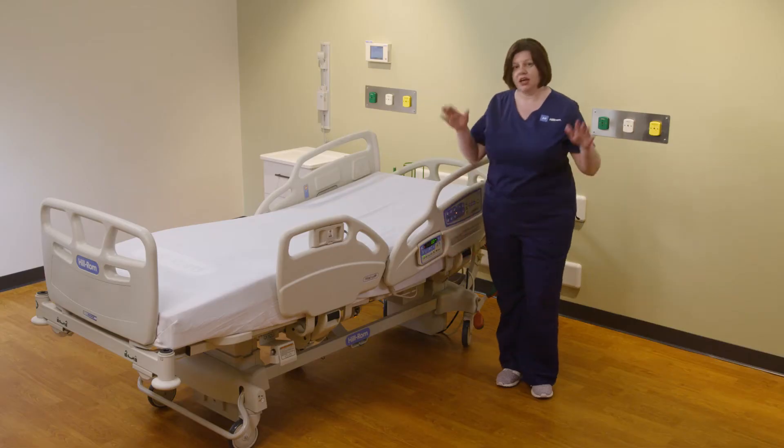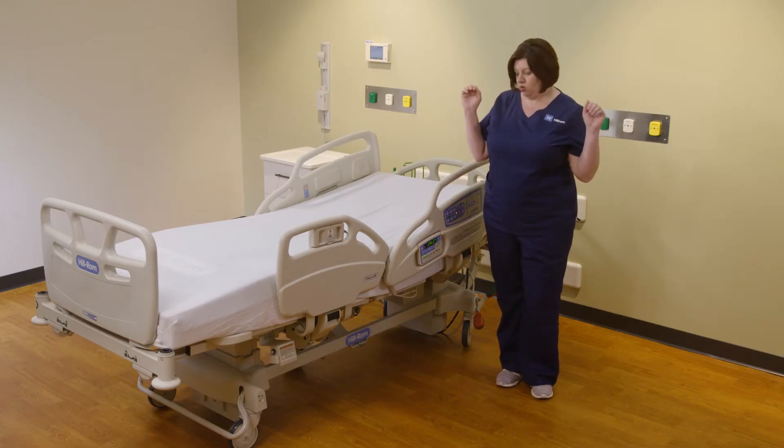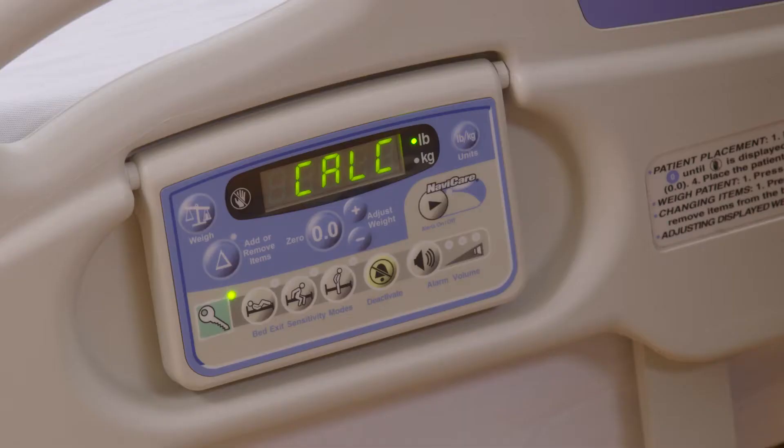Hold that until the hand flashes telling you to let go. At that point, let go of the bed. You will hear a beep and it will tell you that it's calculating.